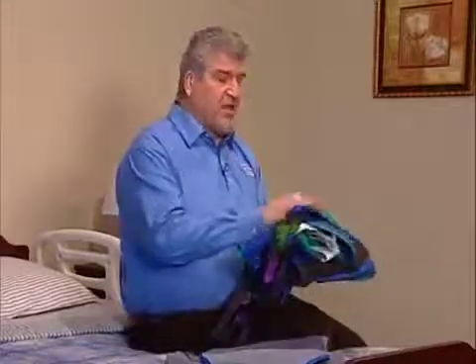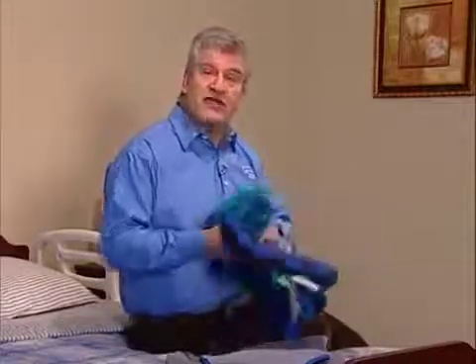Always inspect the sling before use. Check for wear, tears, and loose stitching. Bleached, torn, cut, frayed, or broken slings are unsafe and shouldn't be used.